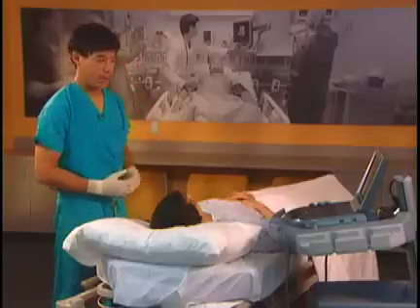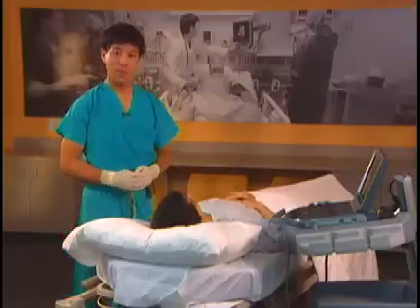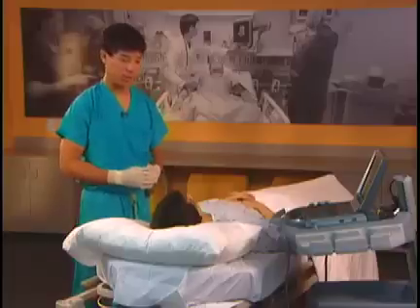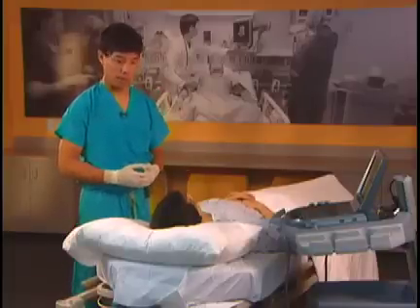The supraclavicular block has made a resurgence since using ultrasound. The reason is we are able to visualize some important structures such as the first rib, the subclavian artery, and the pleura.